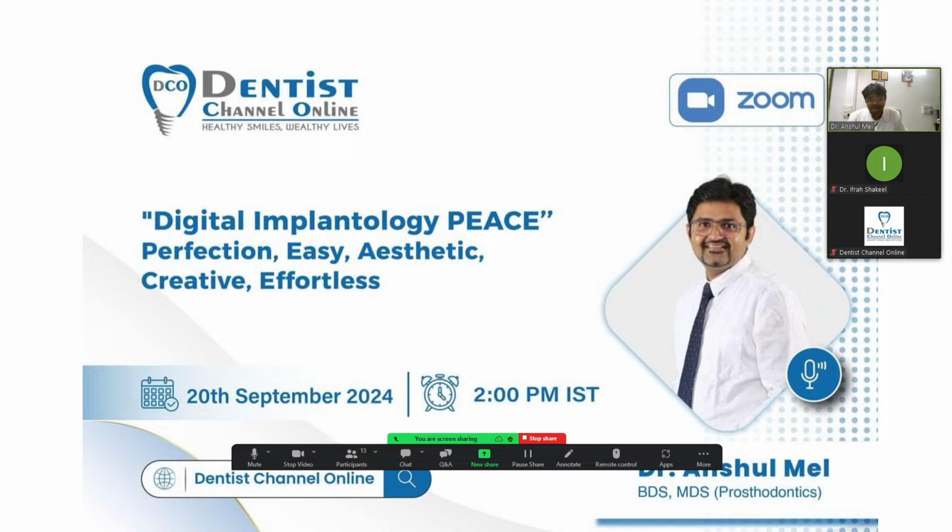Today's presentation is about where you have to start digital dentistry in implantology, from the planning to the end of the prosthetic. So it's only crown to crown, not implant. The implant will play a role after we plan, like building a future building: before that, we create everything and then we place the pillar. That's how this digital era has evolved.